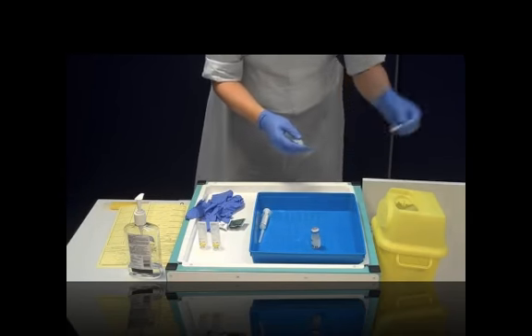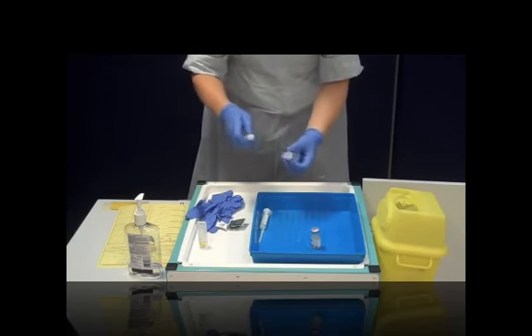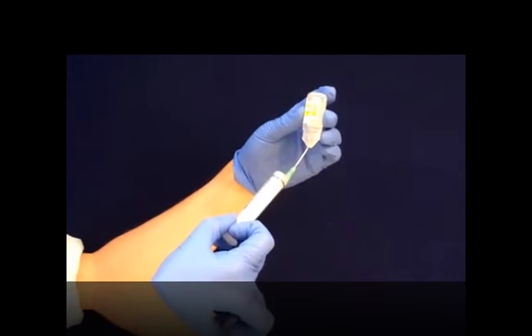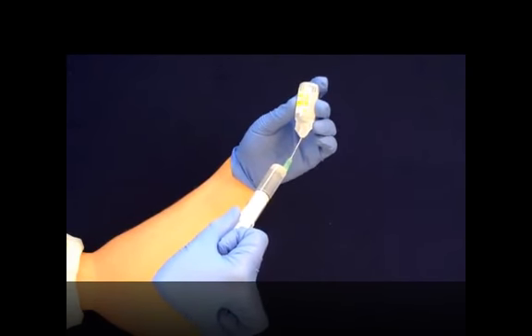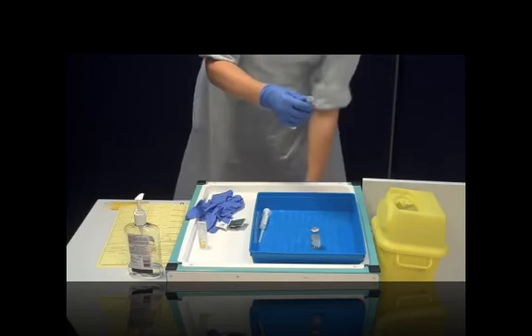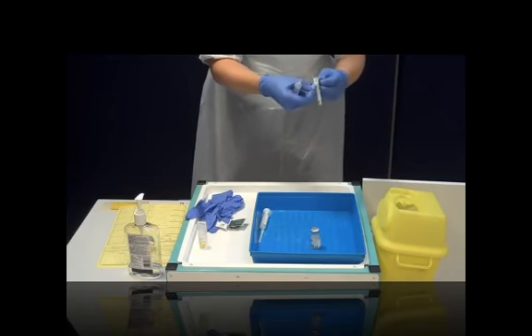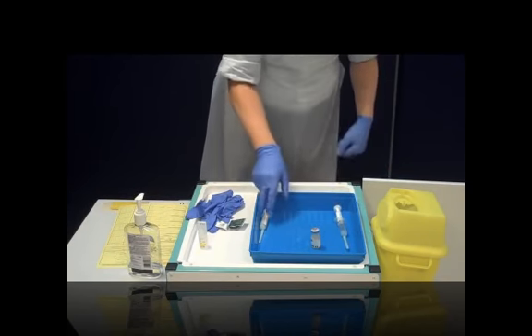Take your syringe and begin by drawing up your flush. Invert the vial and aspirate back 10 ml. Once you've done that, to ensure that you don't resheath your needle, remove the used needle off the end and put it in the sharps bin and then replace it with a clean needle on the end. Then repeat the process with the diluent this time.